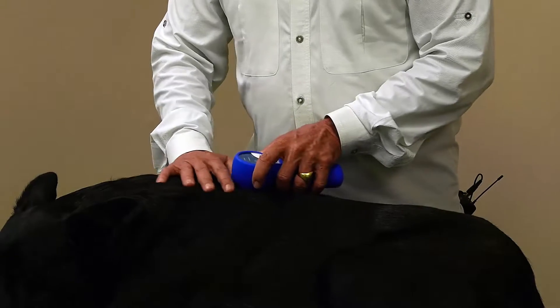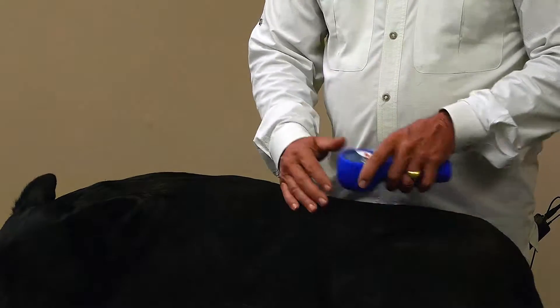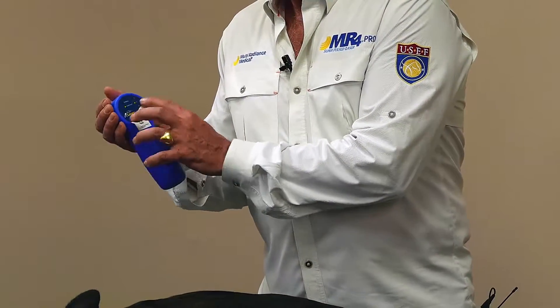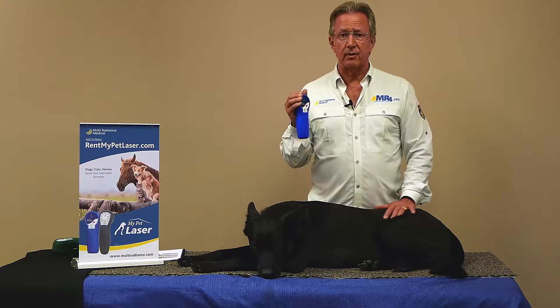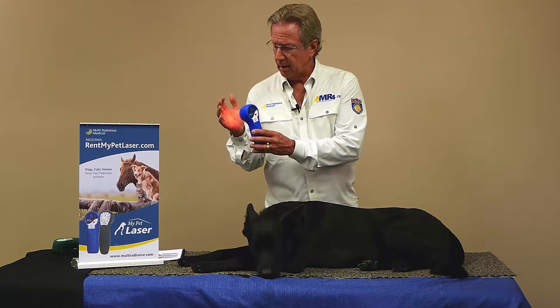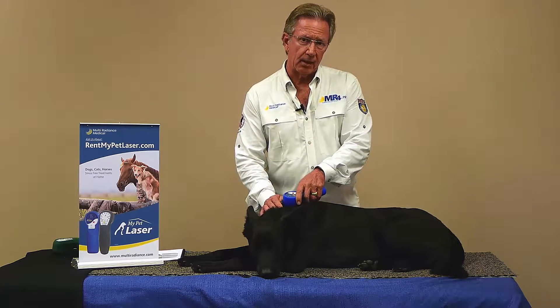This is the unwind protocol — the 1,000 to 3,000 Hertz for relief of pain and swelling. Next we just push the power button, reset it, and now we can talk about doing tissue repair, which would be 250 Hertz. So if your vet prescribes the laser for use with a wound or a post-operative wound, you'll just set that to setting number two, push the button, you're back in operation, and now what we're doing is stimulating production of ATP.